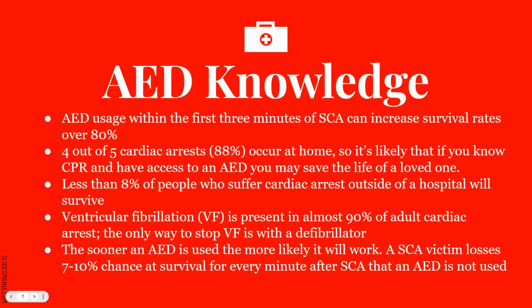Somebody that has a sudden cardiac arrest has a 7 to 10% chance of loss of survival. So a person that has SCA, a sudden cardiac arrest victim, loses 7 to 10% chance of survival every minute after the onset of a heart attack if the AED is not used. So what we're saying is the longer you take to get the AED to that patient or that victim, the chances of survival drop drastically, 7 to 10%. So again, the sooner you get the AED to correct that abnormal heart rhythm, the higher the chances of survival.